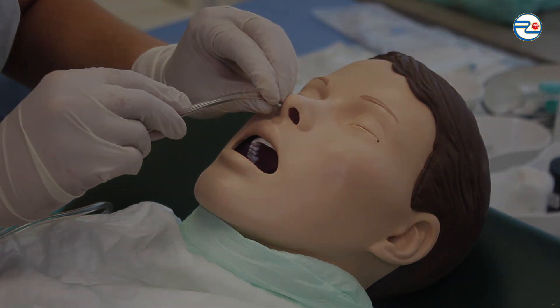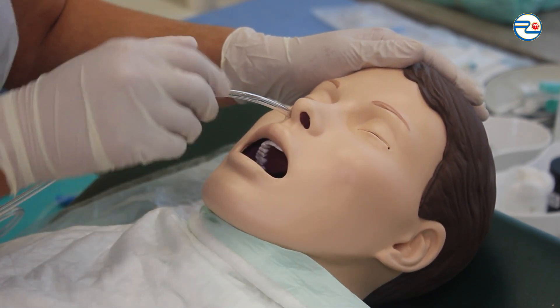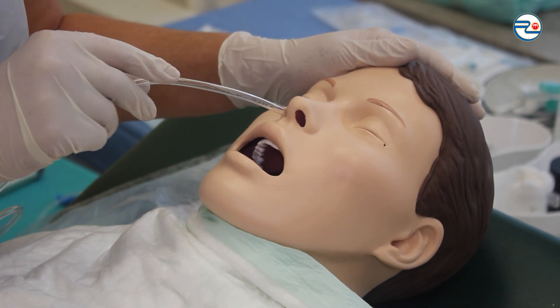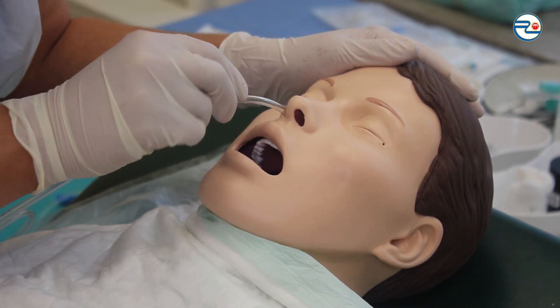If the tube gets stuck, checking if it has entered the mouth, retracting the tube a few centimeters, and then pulling the tube deeper until it reaches the measured mark.